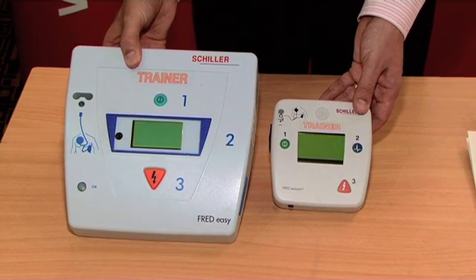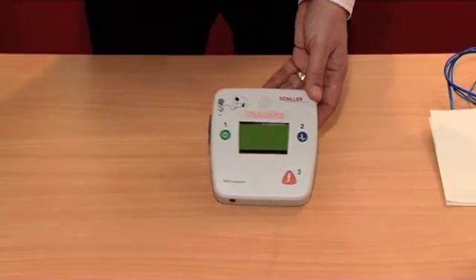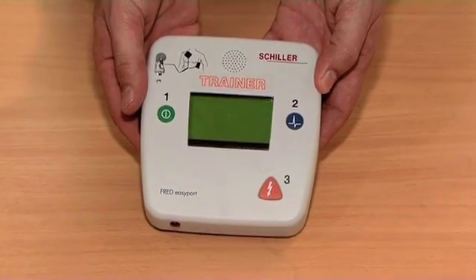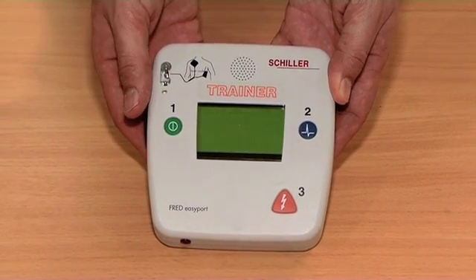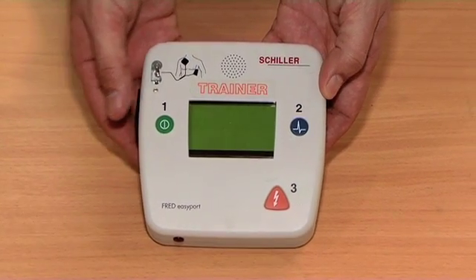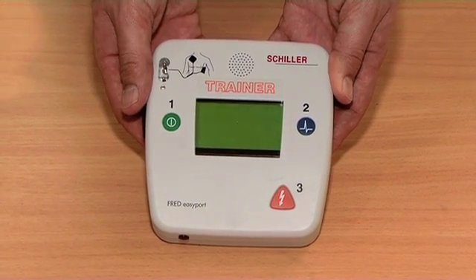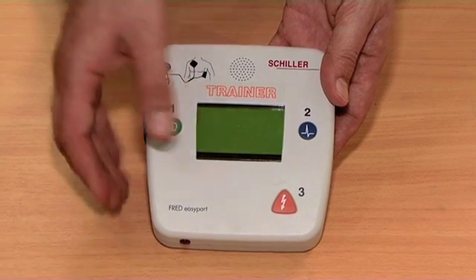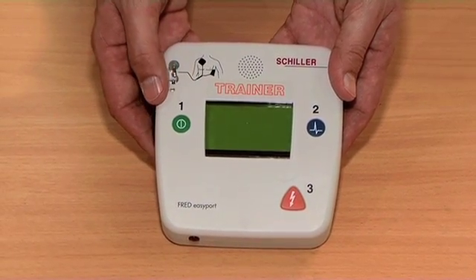There's a huge difference in weight and dimensional size. The Fred Easy Port is a perfect defibrillator for anybody who needs to carry a defibrillator on a regular basis or over a distance, for instance military use, mountain rescue, etc. You can see that the pads are not pre-connected, there are a couple of simple buttons to aid operation, and an ECG screen is optional.